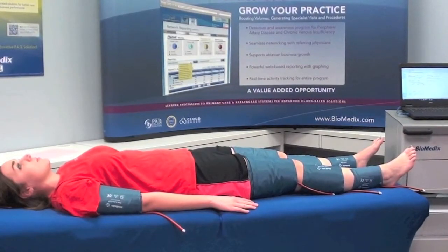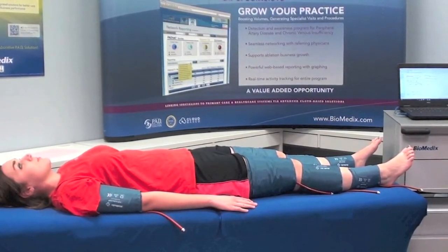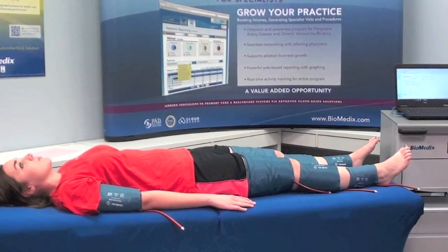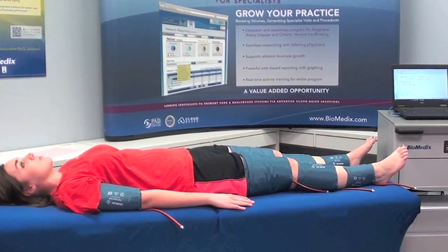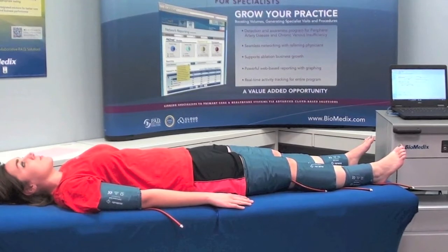During the exam, ask the patient to lie still and keep conversation to a minimum. Test measurements that have been affected by patient movement are usually not acceptable to send for interpretation.